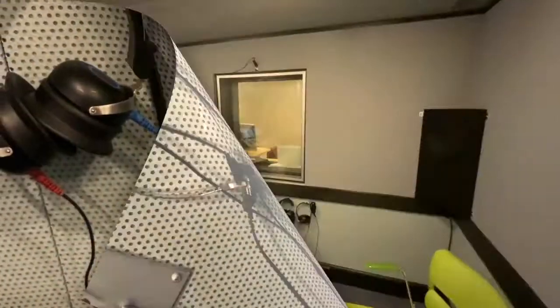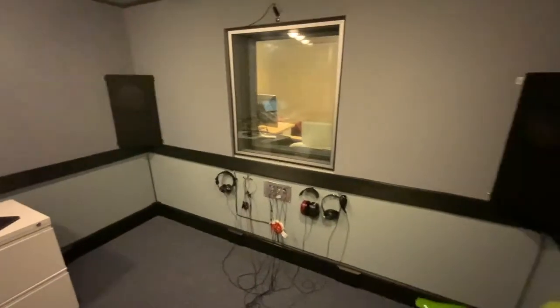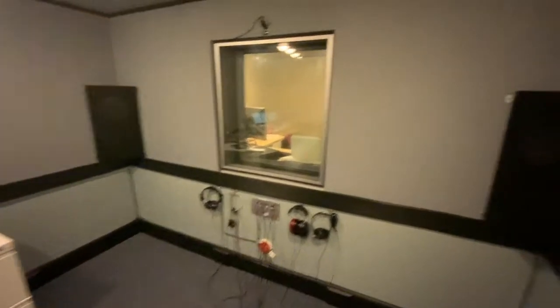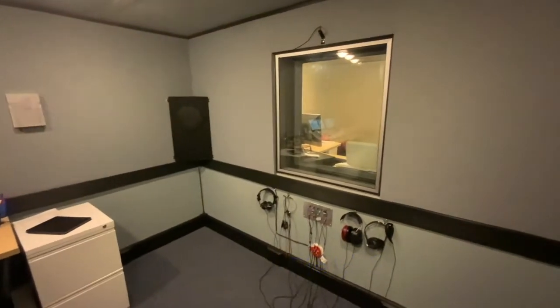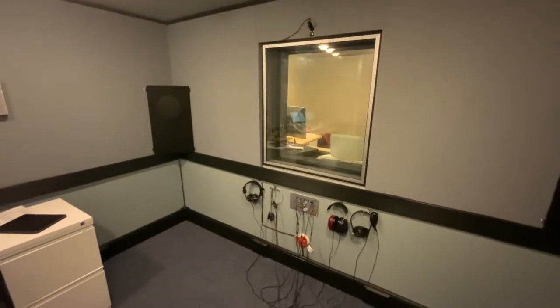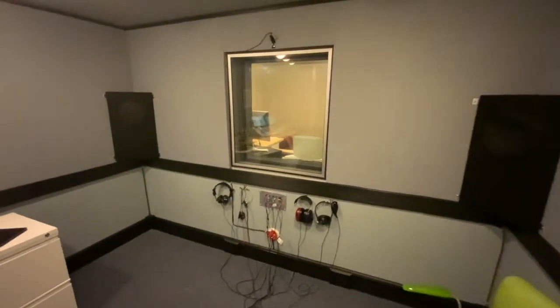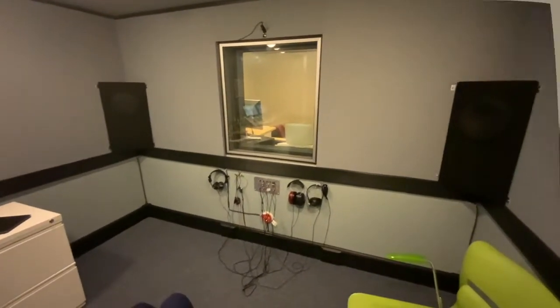Another option, if your client does not tolerate headphones or earphones for any reason, we have a sound field system. So those are speakers on either side of the booth that can be used for things like speech and noise testing or for children when they're doing their audiometry and they won't have earphones in.